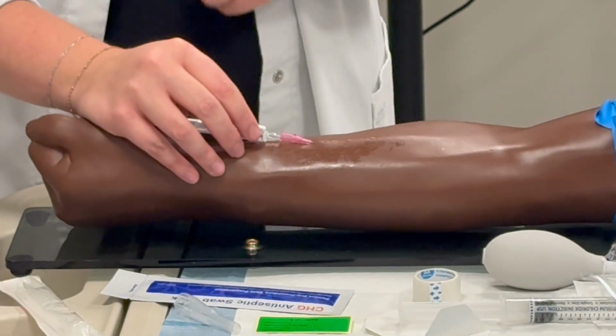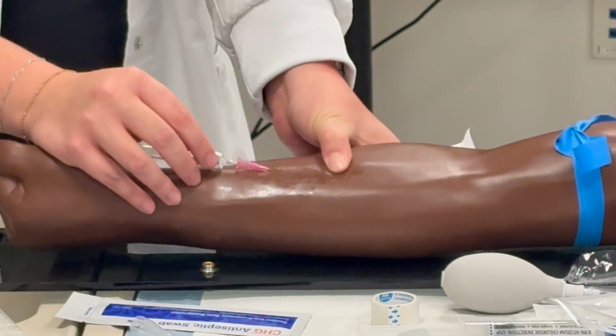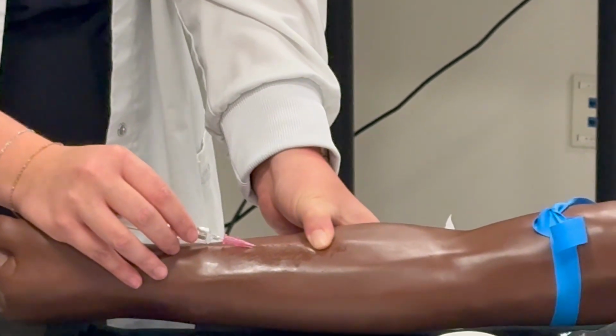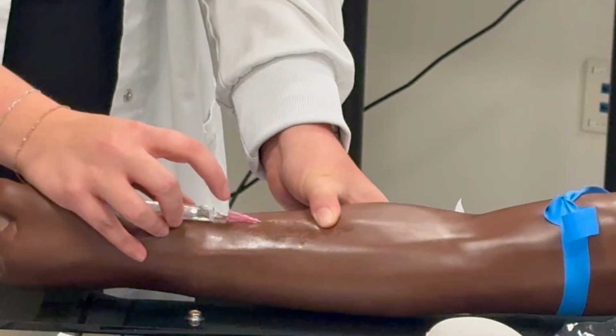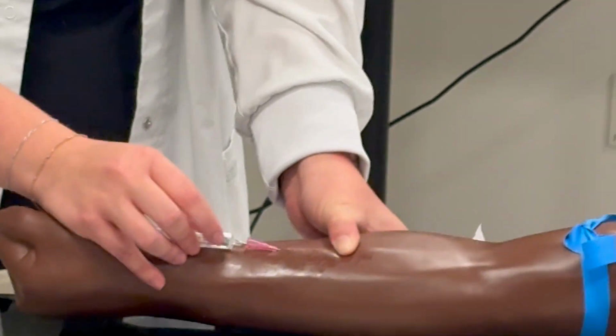So once I have it up here, I'm going to put my thumb up here. Why does my thumb go here? Anybody know? This is just so that the patient, essentially this is like a maple syrup tap into their vein, okay? So if you aren't touching up here, this is just gonna start leaking blood. So you put this up here to try to slow the blood.